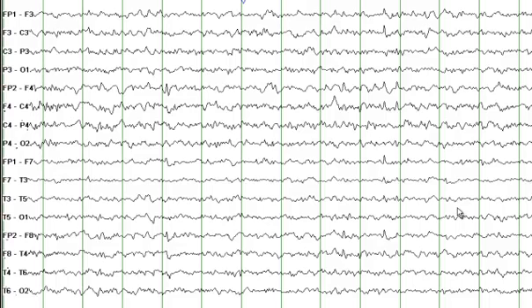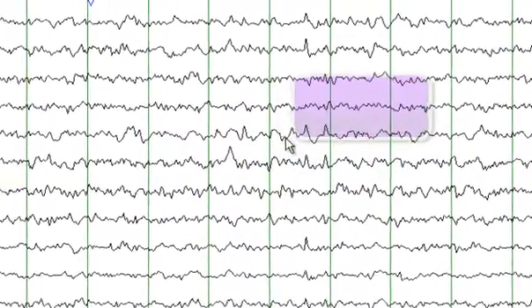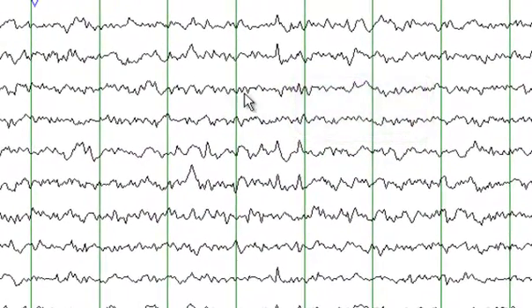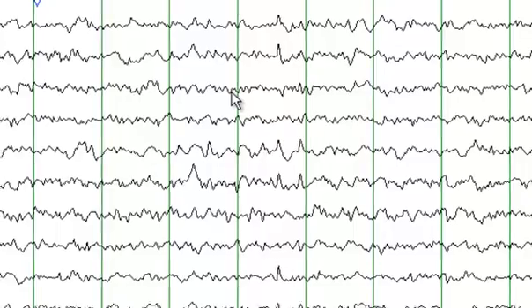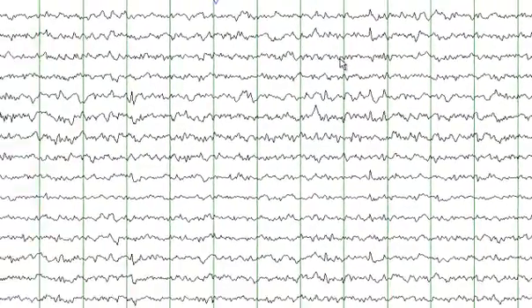Apart from the delta activity, you also see theta frequencies. These frequencies here are the theta frequencies, and there is superimposed beta activity. Beta frequency is a band that ranges from 13 Hz and onwards, so frequencies which are either 13 Hz or higher are classified as beta frequencies.